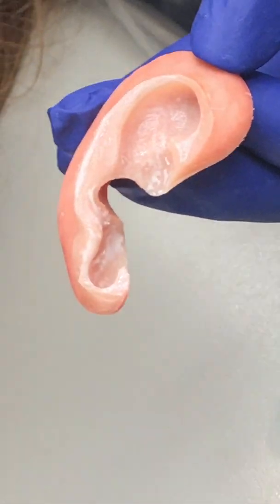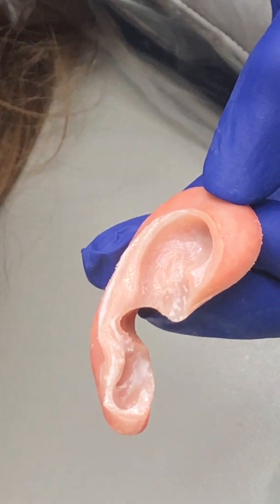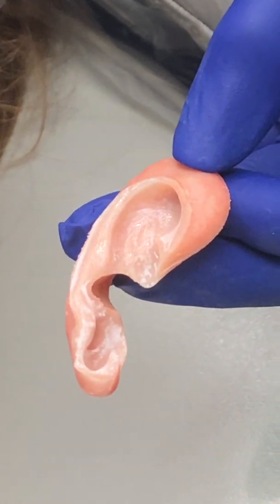Zoom in so you can see that this is white. When the adhesive is white, it's not sticky. So you can take a hair dryer on cool and air dry it until it goes clear.